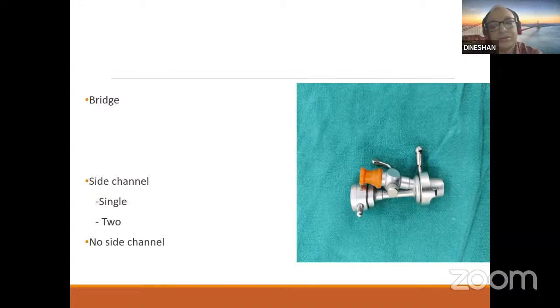And you have a telescope engaging channel, and depending on the type of bridge you are using, you can have either a single side channel or a two-side channel, or there are some bridges with no side channel also.